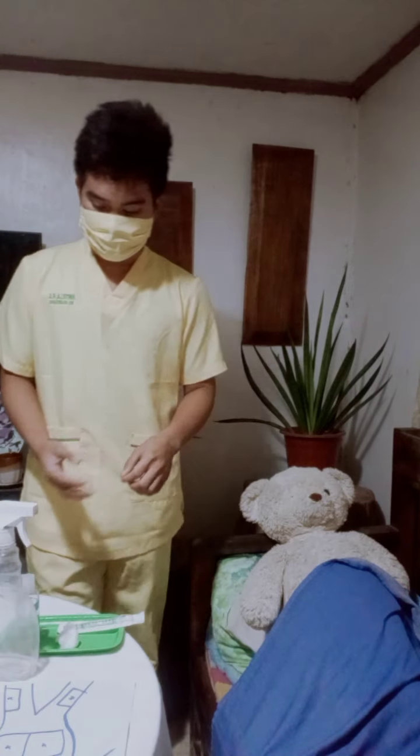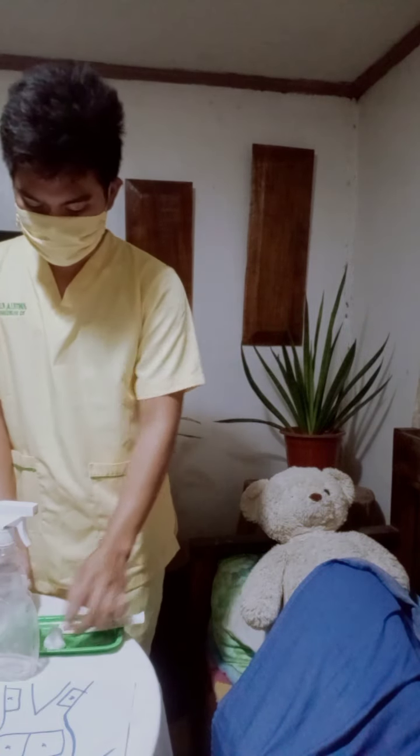To have enough time and to facilitate easy access to the equipment that we're going to use, then have the patient wash their hands. Then we can use another disinfectant like alcohol to wash our hands at the same time, just like this.